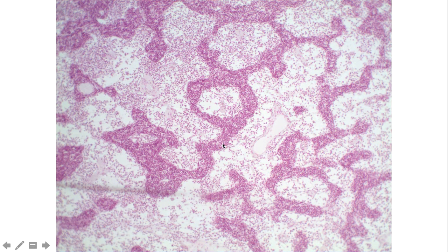Now, the name given to these linear structures containing all the lymphocytes, these are the medullary cords. And so a term you'll see on your list, the medullary cords, is just a supportive area where a lot of lymphocytes are arranged. Again, the idea is the lymph will move through these sinuses, and as it does, it's going to be passing between and around and through these lymphocytes. The lymphocytes are going to be able to monitor this lymph.